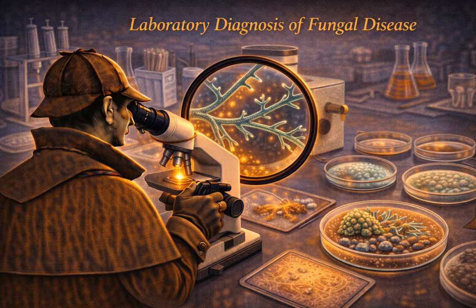Calcofluor white is a fluorescent stain. It has a very high affinity for chitin and cellulose. It binds specifically to the fungal cell wall, and then you turn on the UV light and the fungus just lights up. Depending on the specific filter you use on the fluorescent microscope, it glows a brilliant blue-white or sometimes a bright apple green. It is virtually impossible to miss.